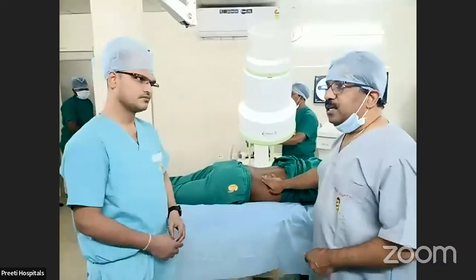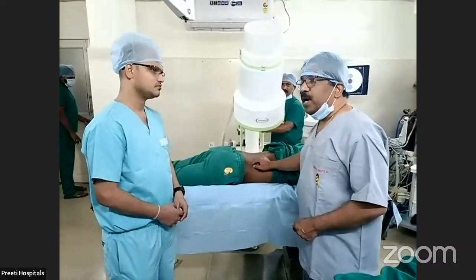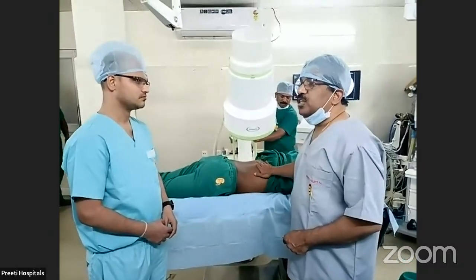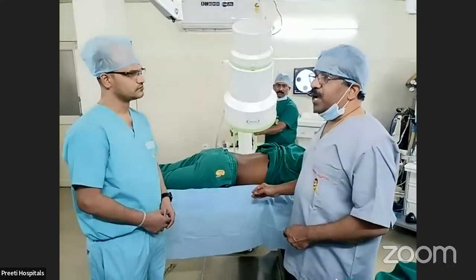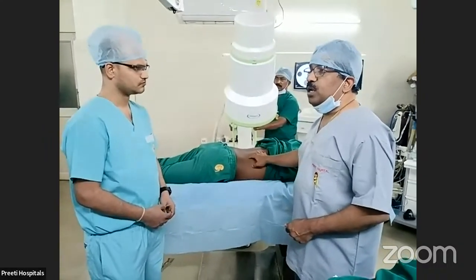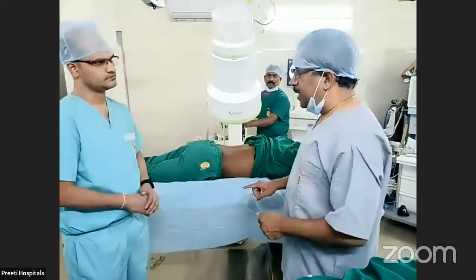After the puncture, if the needle goes more towards the spine when compared to the stone, it is posterior. If the needle is away from the spine in comparison to the stone, you are more anterior. Clear? I will repeat again.